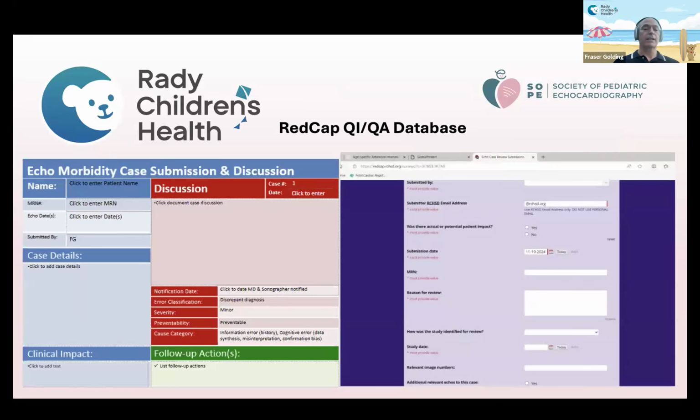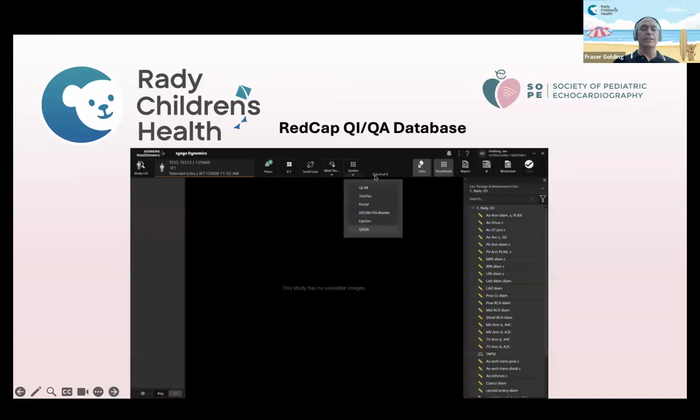I shared with you before, converting a PowerPoint presentation of echo morbidity and quality things into REDCap submissions, where we can submit cases. We launch it through Syngo Dynamics. So we use the third-party launcher. It really just allows you to launch either applications or web pages from within Syngo.